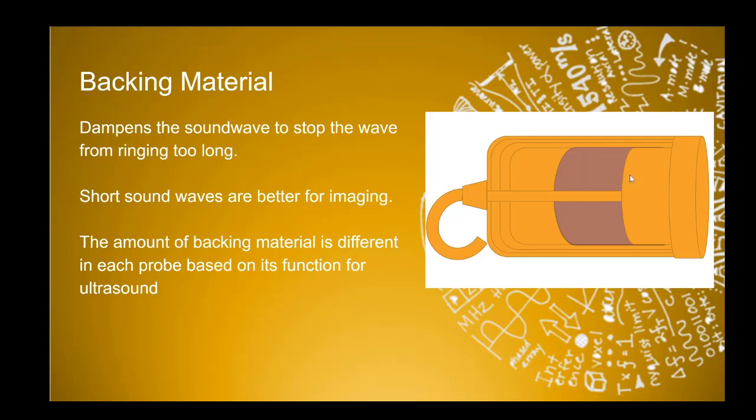The amount of backing material is going to be different for each probe, and it depends on the function of the probe. Now we talk about diagnostic imaging because that's what we're doing. That's what we're learning about, right? There is also ultrasound being used to test building materials. You can use ultrasound to be therapeutic.